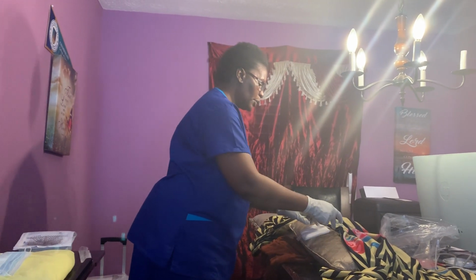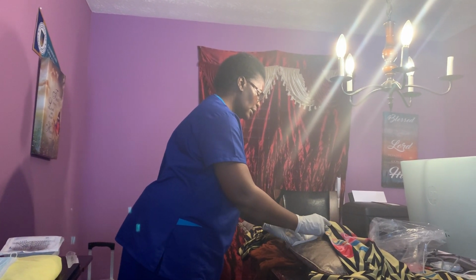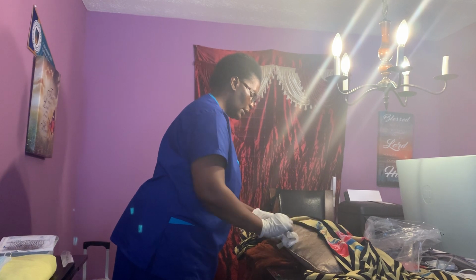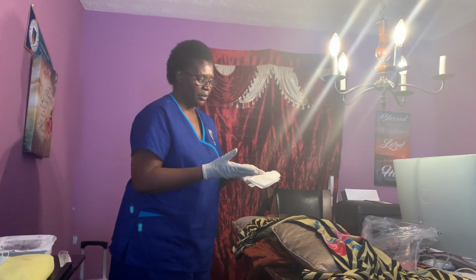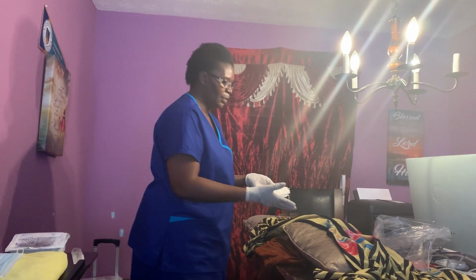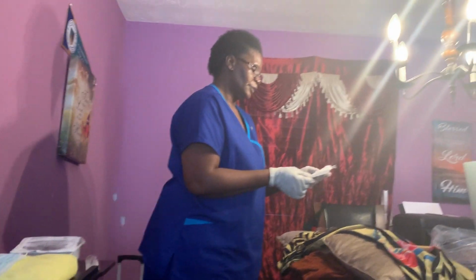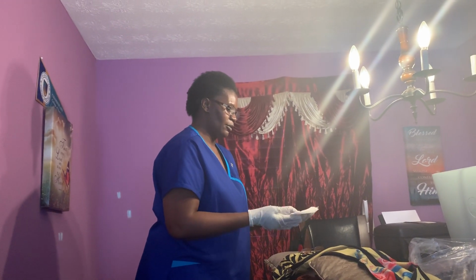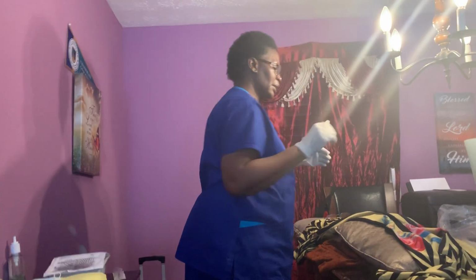So I'm gonna peel off the dressing, the tape from the skin, gently, gently, and then I take it off. Now I'm gonna examine the gauze, the part where I took the dressing from. It's a wound on the thigh here. So I'm gonna examine it and look at the back, and the drainage is moderate, and I sniff it, but there is no odor. So now that I've looked at it, I'm gonna examine the wound itself. So I'm gonna put that in the trash.